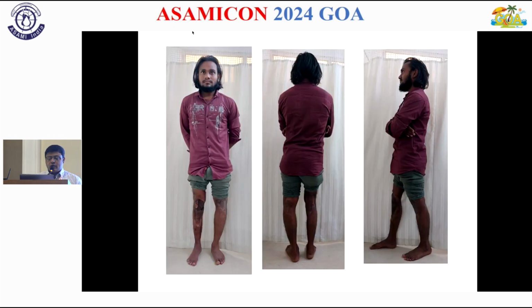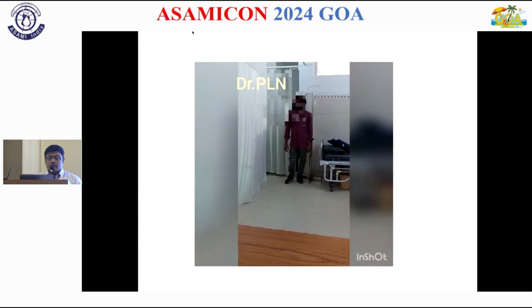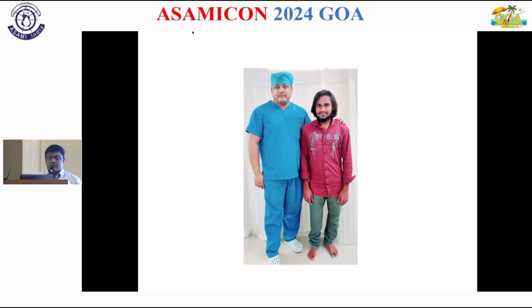We kept it a little short and a little flexed for ground clearance as it is a fusion knee. This was before and this was after. You can see he's walking. All the stress on all the other joints, hip, everything was relieved.